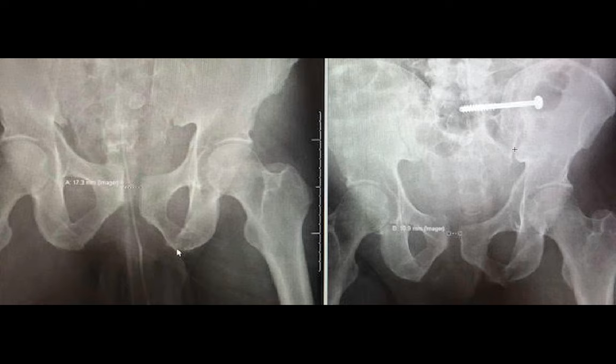So that's just my thought process. But again, everybody is a little bit different. Certainly, there are pelvic surgeons who would think that this is sacrilege, and others may agree with me, others may not, but that's sort of the beauty of what we do.